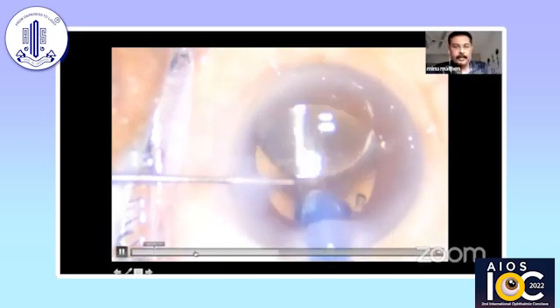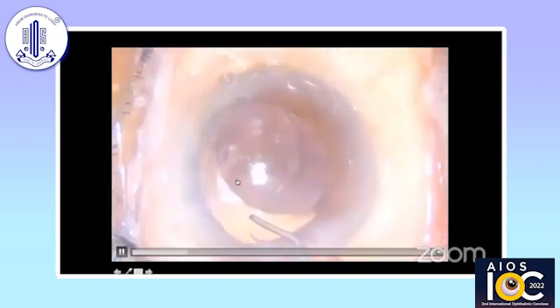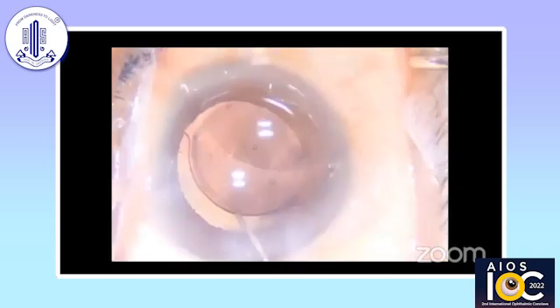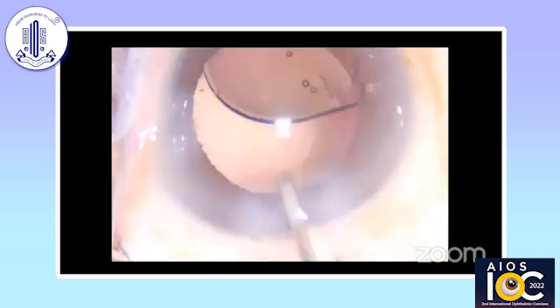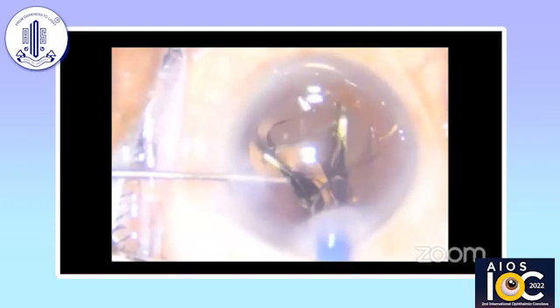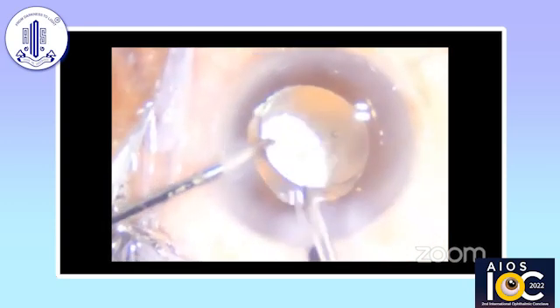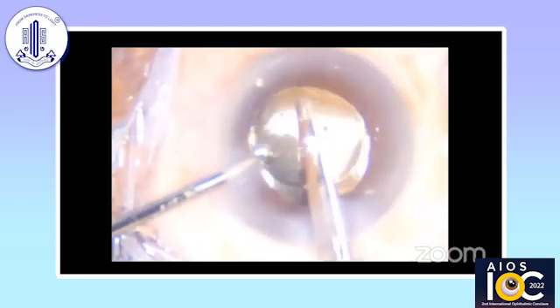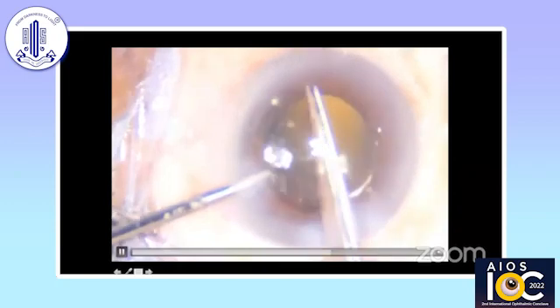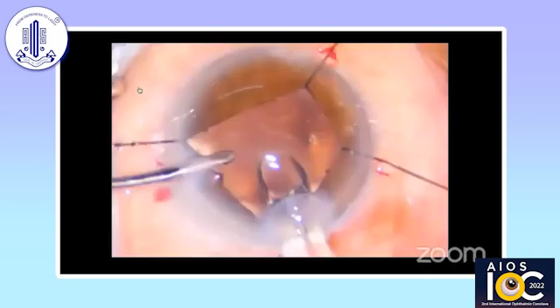In this case with haptic damage, we want to get an IOL scaffold so that we don't damage the posterior capsule, the iris, or the anterior capsule margin. The second IOL is placed inside the bag first, then we cut, bisect, or take out the damaged lens. The key is to have sodium hyaluronate or viscoat which will stay inside the bag and keep it inflated. I go in with the same Vannas scissors, hold it up in the AC, and the side paracentesis micro-forceps hold it very well. I cut into two pieces and explant as shown before. Partially cutting and taking out is another option.